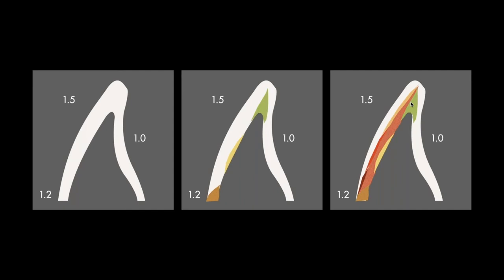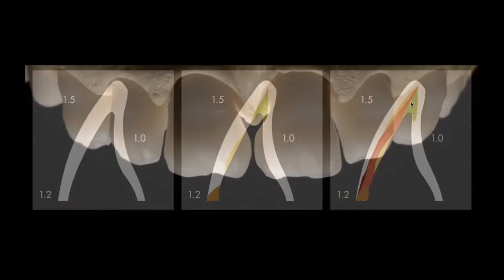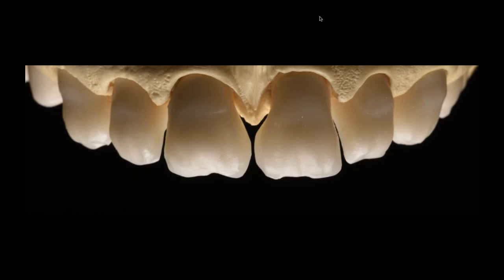And that's why I started to say before, when I'm doing these courses, it's almost impossible to do ceramic courses today without having your design team involved in it, because this is the part of the process that really makes life easier for you in the ceramic layering process. So almost all the cases we do in zirconia today, and I wouldn't say we're perfect with this yet, but we're getting better and better every day.